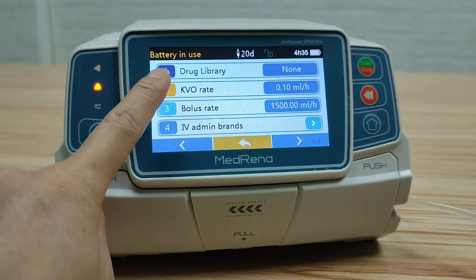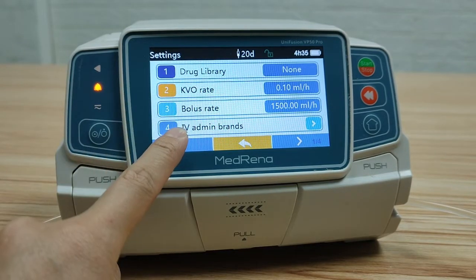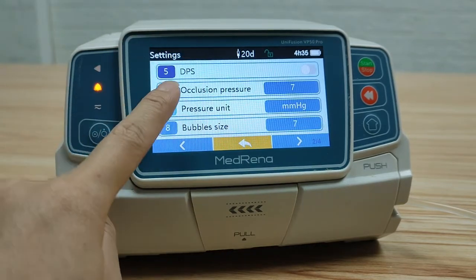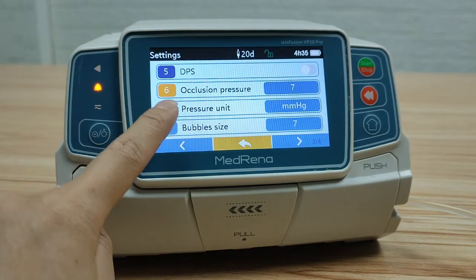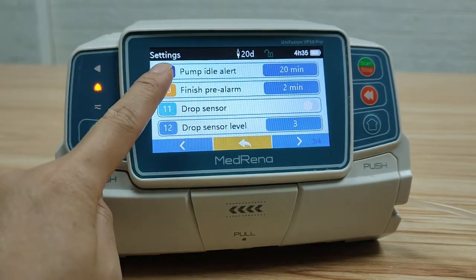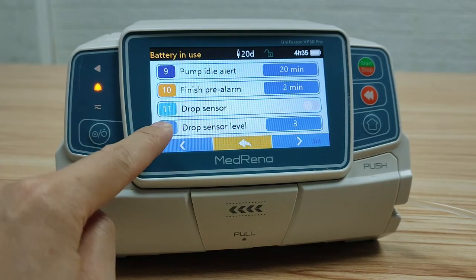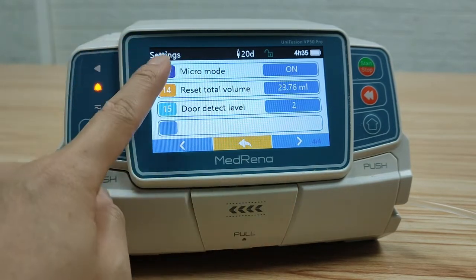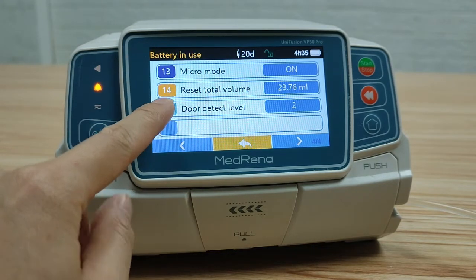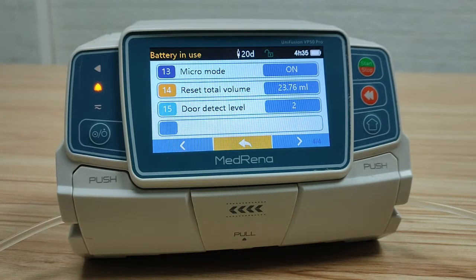Under settings we can configure drug library, KVO rate, bolus rate, IV brands, DPS, occlusion pressure, pressure unit, bubble size, pump idle alert, finish pre-alarm, drop sensor, drop sensor level, micro mode, reset total volume, and door detect level — a total of 15 items under this setting.